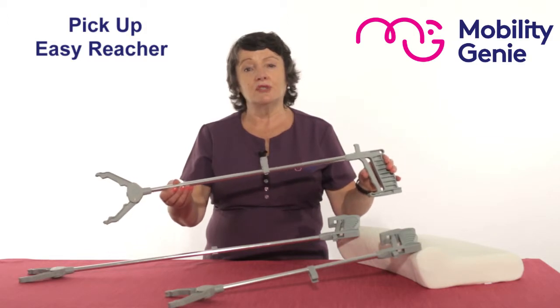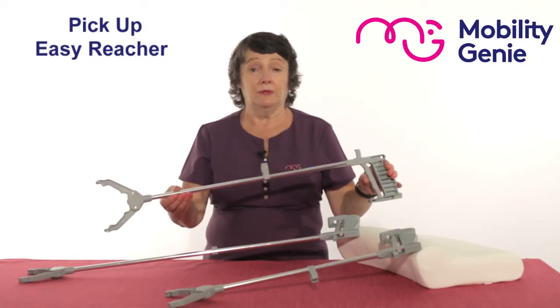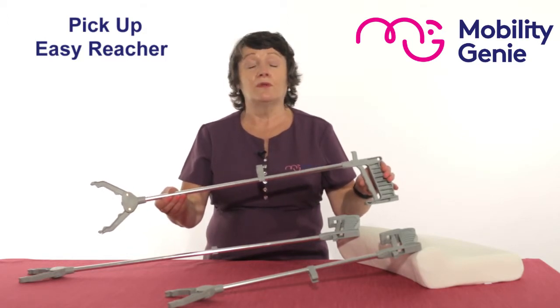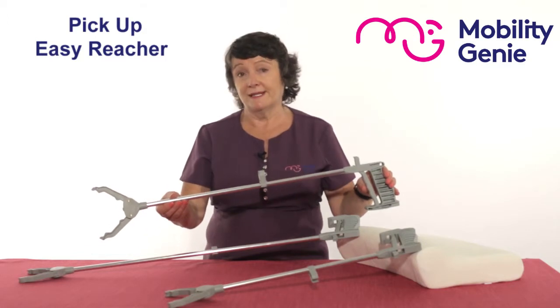If I was to use the larger one, the longer one, it would get in my way when I'm trying to pick something up. And if I use the shorter one, I have to overextend to pick something up. So this for me is ideal.